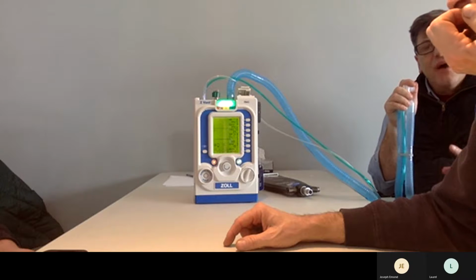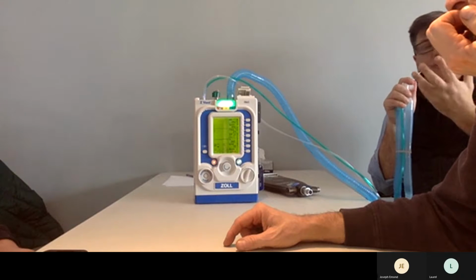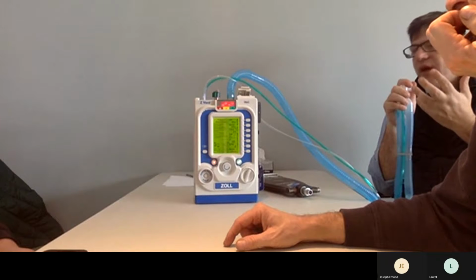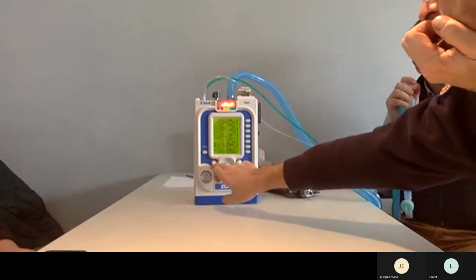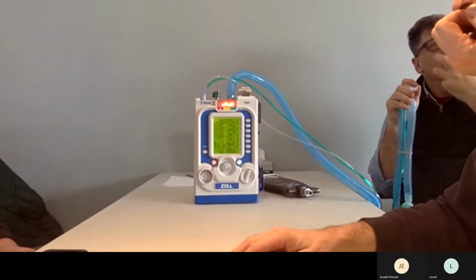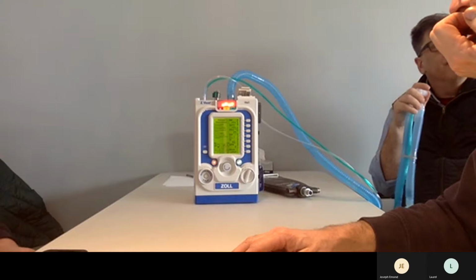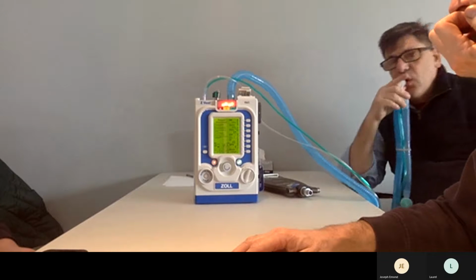But because of that, we now just get to hold the mask on. There's a little bit of leak, or they have a beard or a mustache. It doesn't matter. As a matter of fact, Zoll recommends the end-tidal CO2 in the nose up over the ears. Do you have a leak with that? So the protocol is CPAP with end-tidal CO2. Done. Perfect.